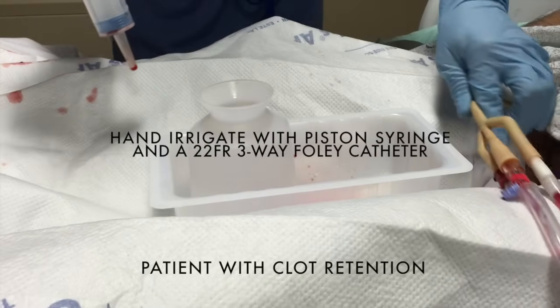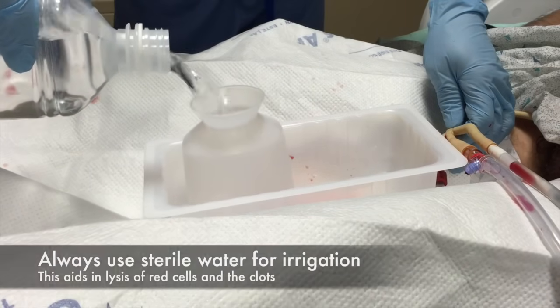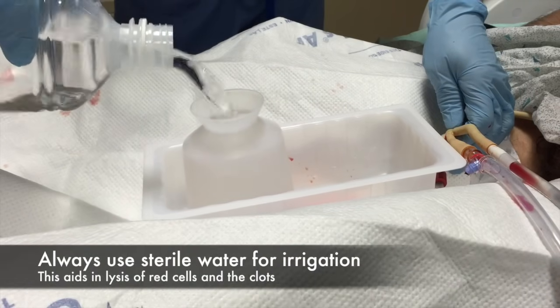This is Dr. Margolis. I'm going to try to explain how to irrigate a three-way catheter using a piston syringe.